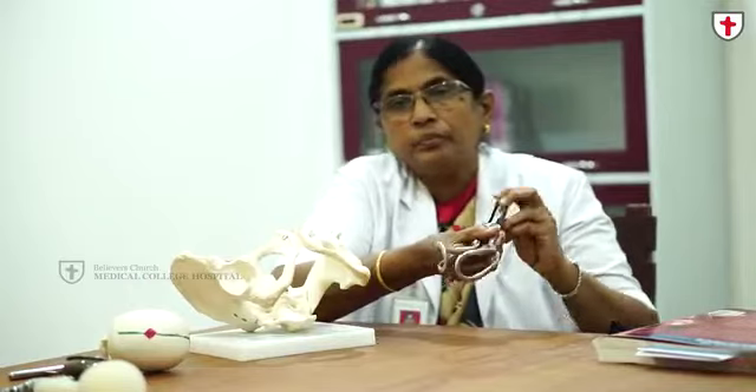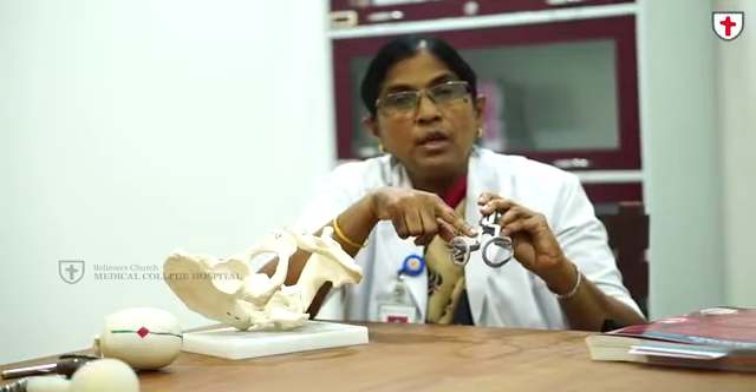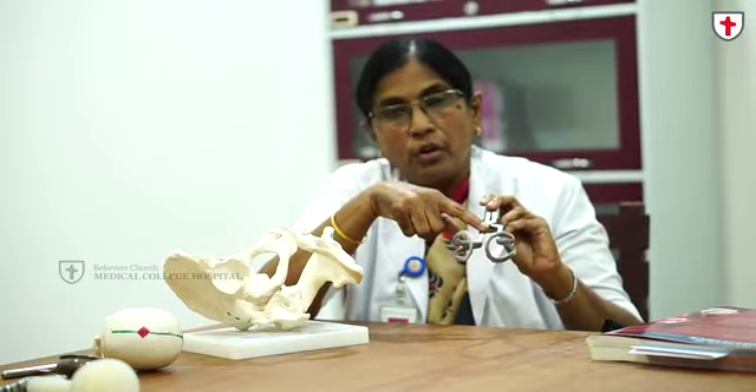Coming to the forceps — this is an outlet Wrigley's forceps. Forceps has three parts: a blade, shaft, and a handle. The blade is fenestrated to produce less trauma to the fetal head. In the outlet forceps, the shaft is very short. The lock is a sliding type of lock.